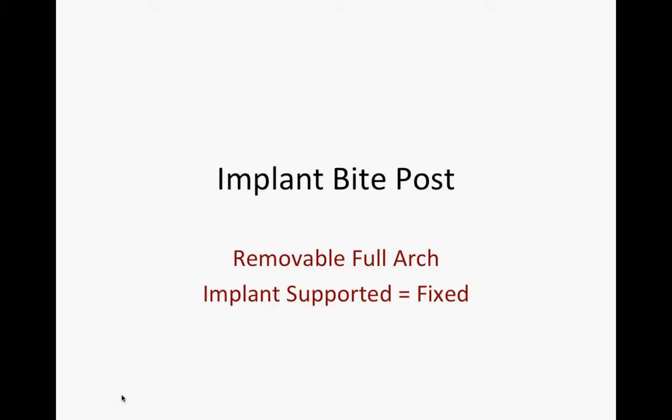We have full arch removable and then fixed implant cases, but a question often comes up for removable, like Dean mentioned: you can make an impression, but you don't want to make a bite record on soft tissue. It's a good question.